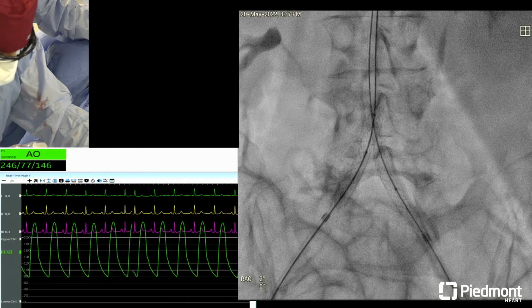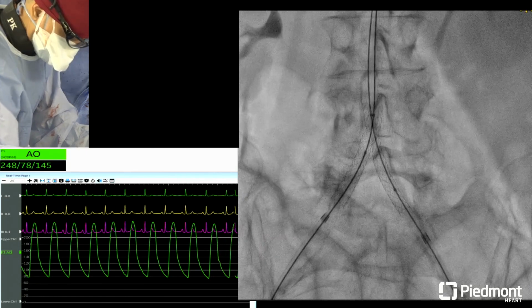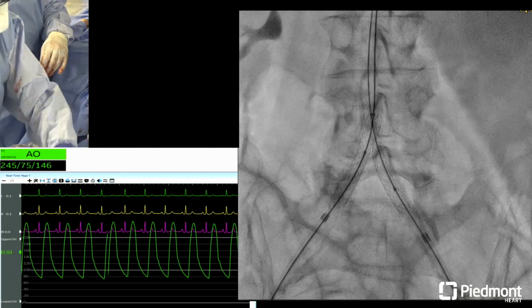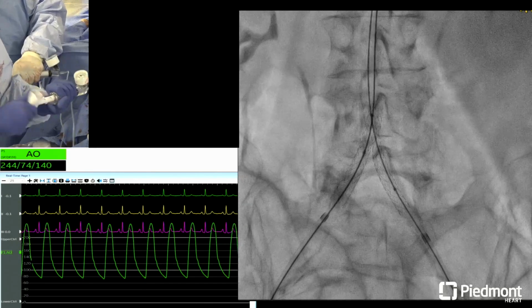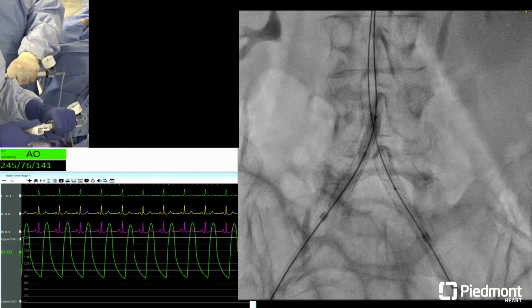I don't think we need to cover it all. I know you guys are discussing that. I think we'll see what it looks like. And then the key thing is getting our closure out, right? Are you ready? Let's go up to 4, please. Where are you approximately? Show me. Okay, there you go. I think that's going to be the challenge, making certain that you have good expansion.